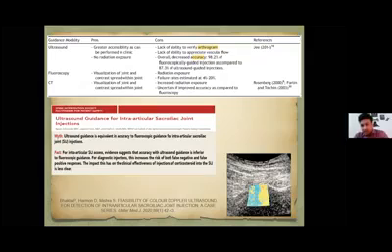I found this very interesting study in which they have used color Doppler for ultrasound intervention. Like we are discussing, in ultrasound we won't be able to give contrast, and we won't be able to verify whether it is intra-articular or not. So what they have done is they have used color Doppler. They have placed the needle in the joint, and now they are injecting the drug.